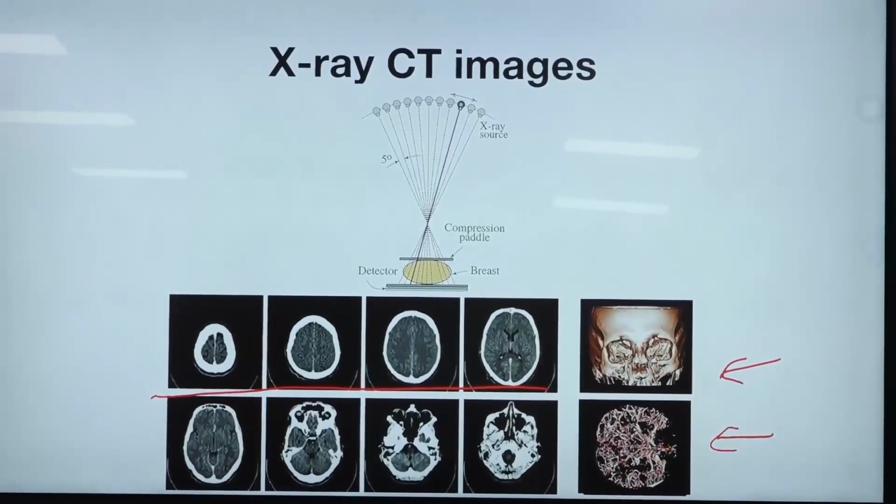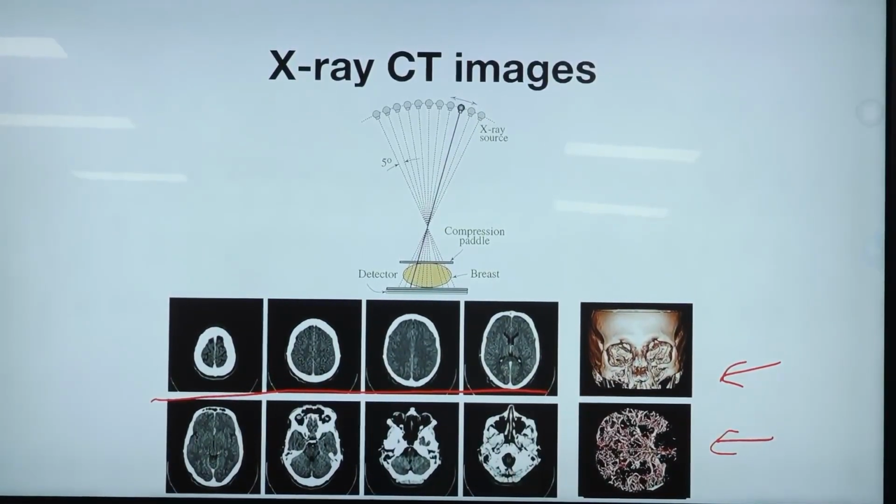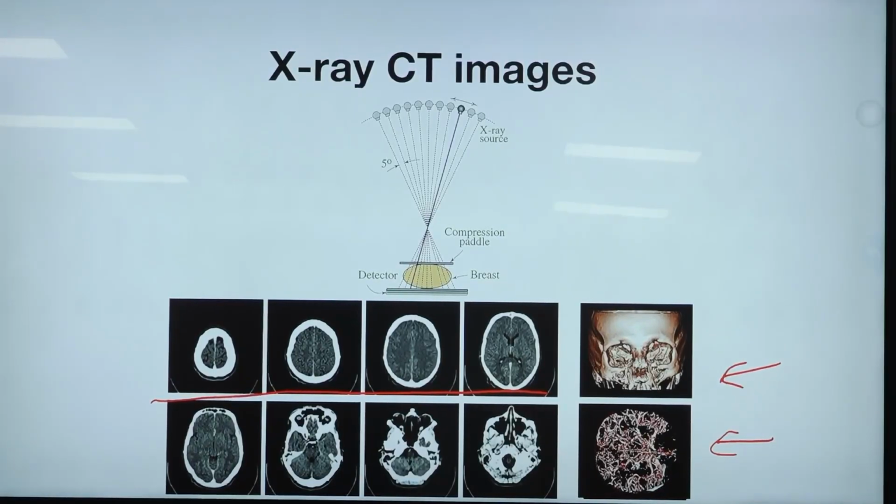You can even measure the brain, like the distribution of the blood vessels or some things in the brain. You can even get a 3D reconstruction. This could be useful, for example, if a person has suffered a stroke, and there are a lot of different kinds of situations where something of this sort could be useful, and you can see inside the head and figure out what exactly is going on. Okay, now is a good time to pause.